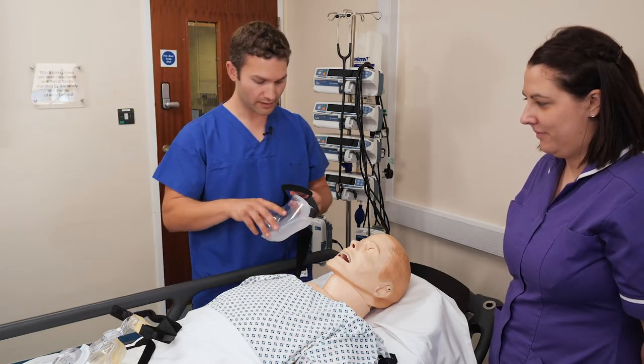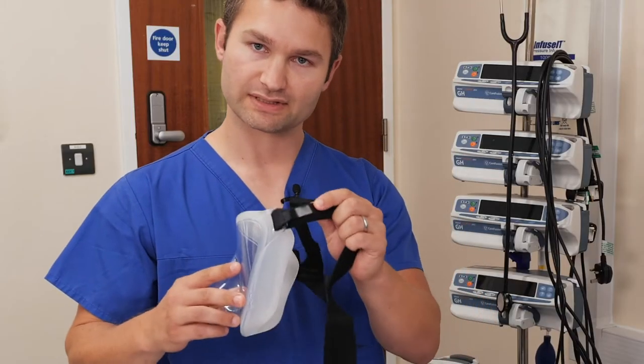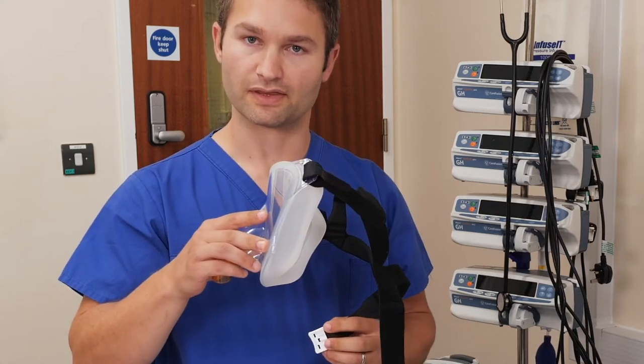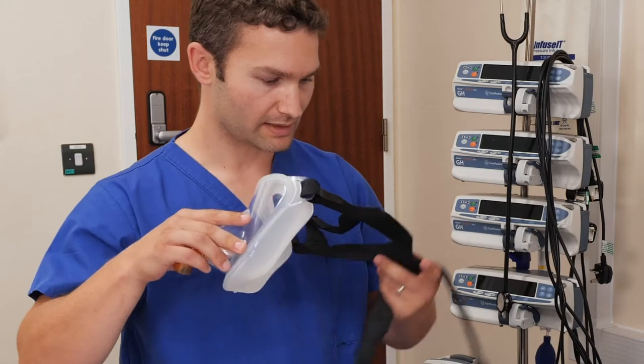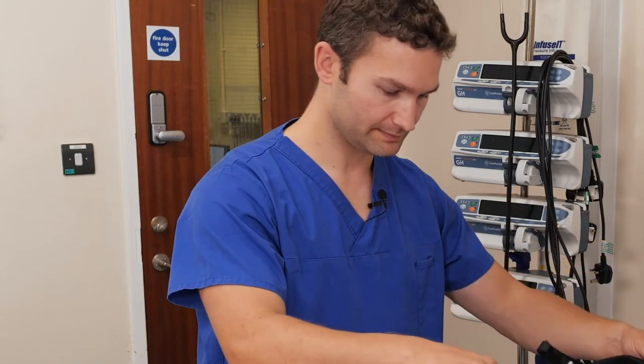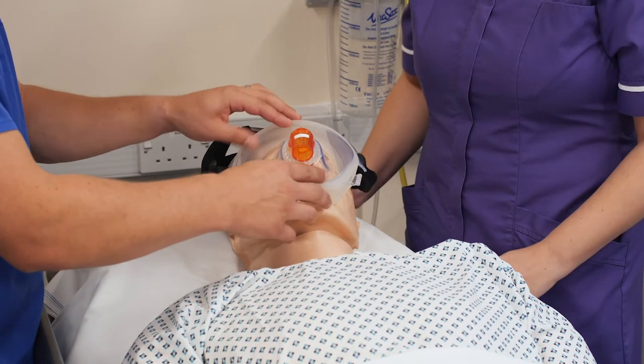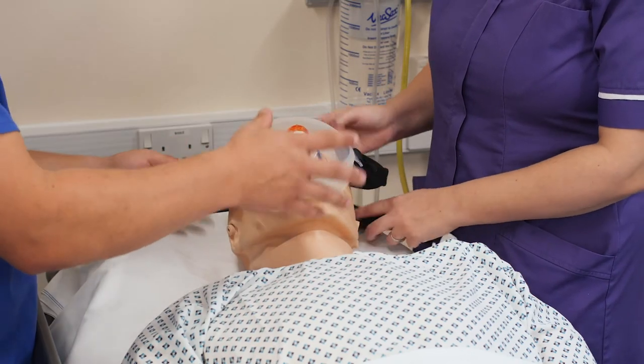When we're going to put a full face mask on, make sure the straps are on the loosest setting to begin with and you can undo clips at the back so you can secure it around the back of the head. We can place the mask onto the face. You want to put it in a central position resting on the chin and the forehead so you can achieve a good seal with the face itself.